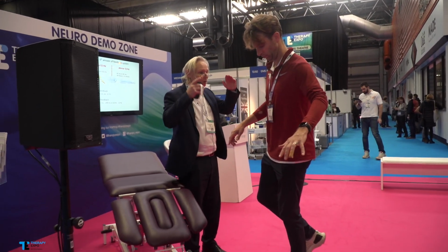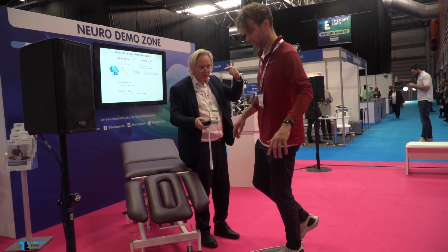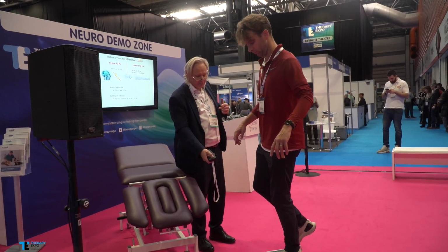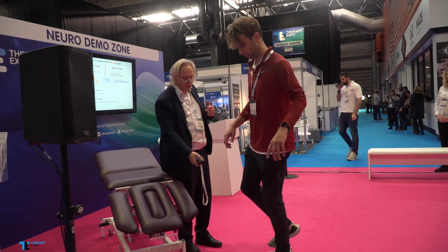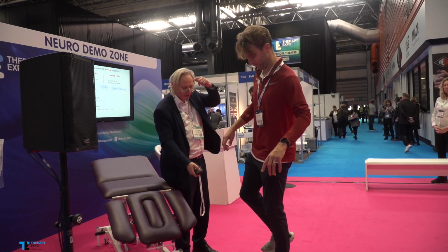So then it's normally quite easy because we have the spinal feedback system. You don't have to think about it. And now if I go lower below 12, then now we have 14 hertz, 13 hertz, 12, and now we come below 12, and now it's getting more and more difficult. Now he has to think about it.